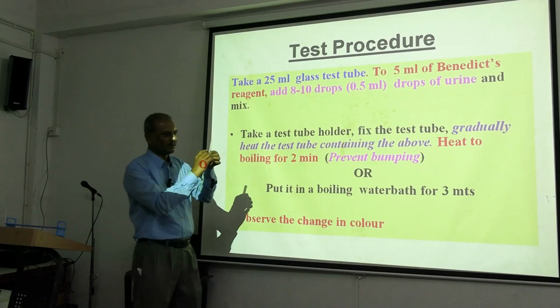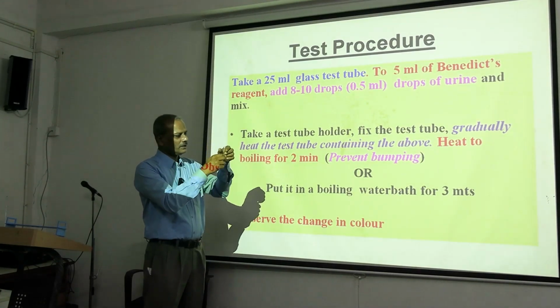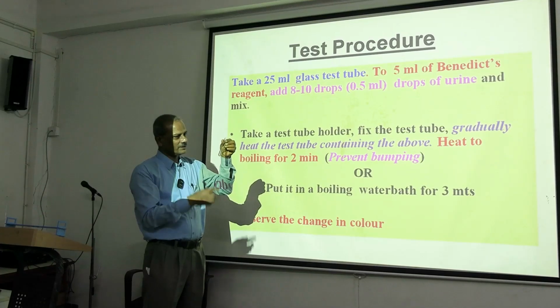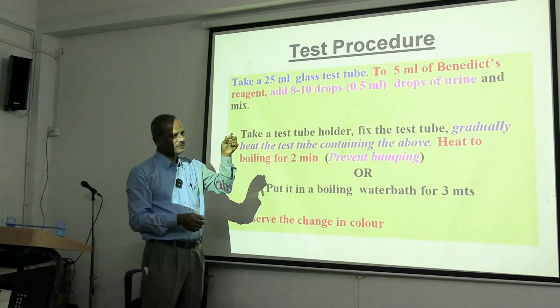This solution has 300 grams of solute that you have added to it. So you have to constantly shake it so that it gets mixed.